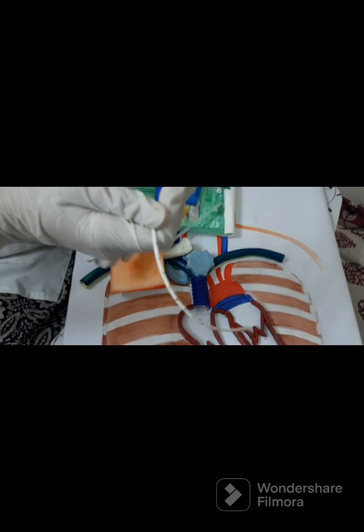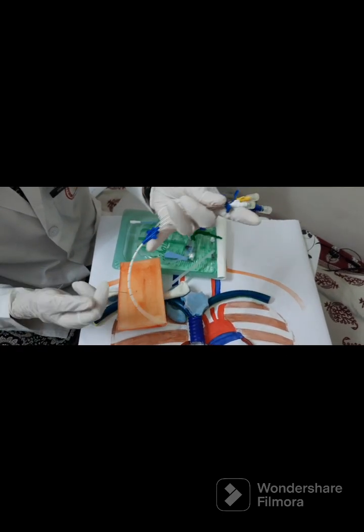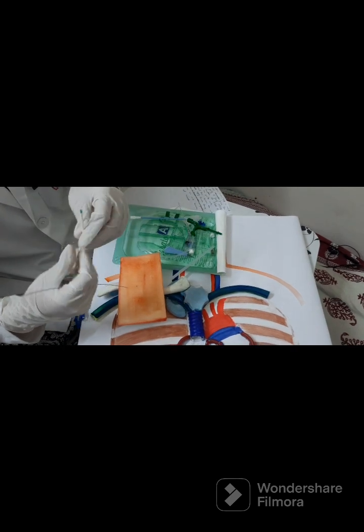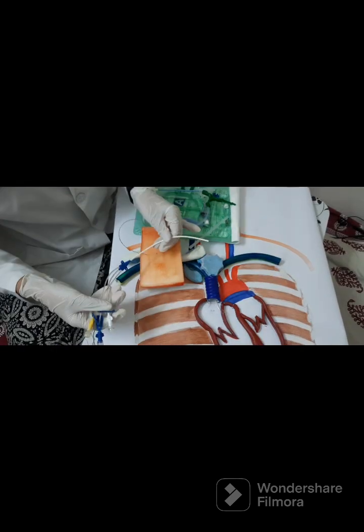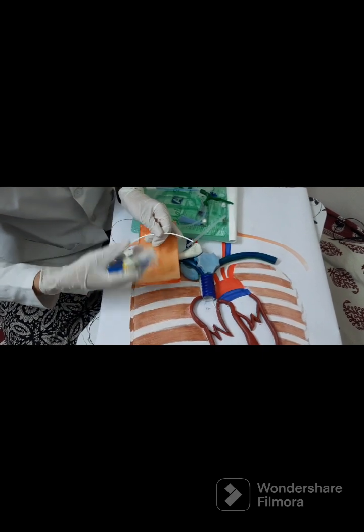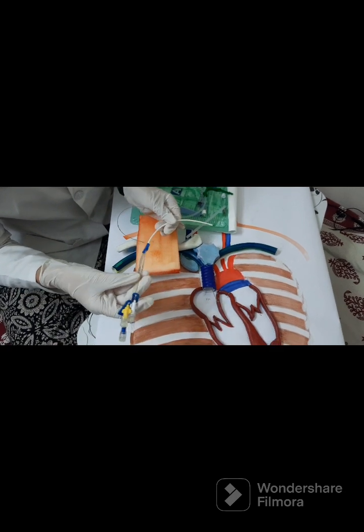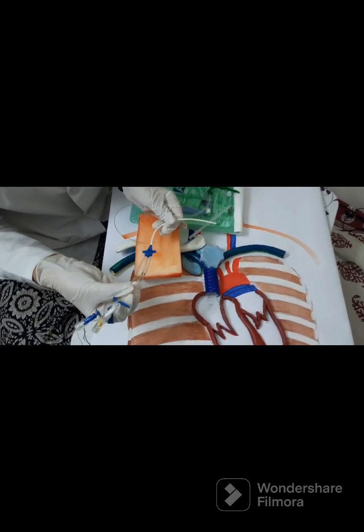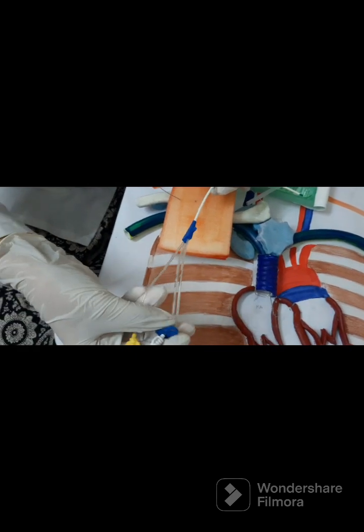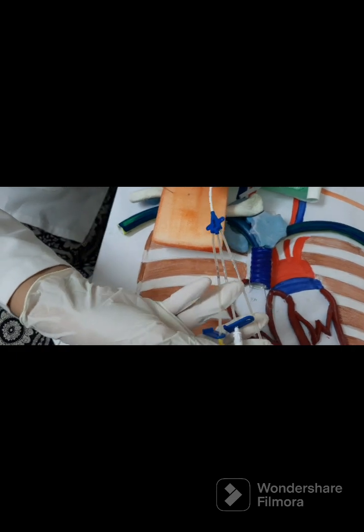Now this is the central line. This is a triple lumen central line. We'll keep holding this wire. Then we'll pass the central line's lumen over the wire and along the track. Now we will pass the central line over this guide wire. This is a central line catheter. It has triple lumen, in which this is the proximal one, which is 18 gauge. This is the distal one, which is 16 gauge, and this is the medial one. It also is 18 gauge.